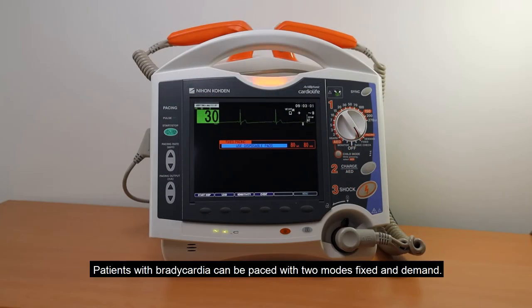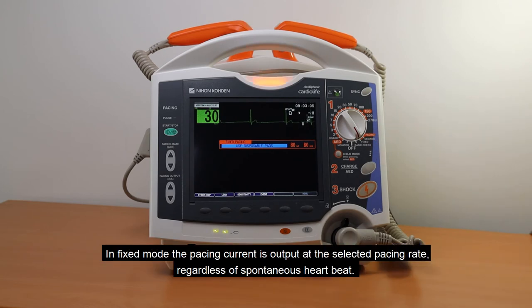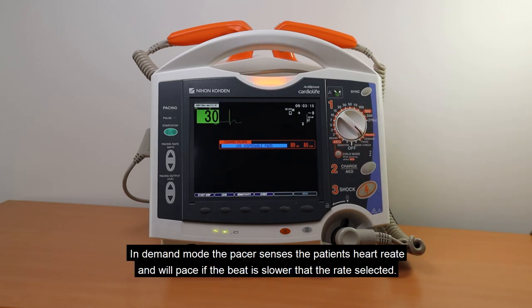Patients with bradycardia can be paced with two modes: fixed and demand. In fixed mode, the pacing current is output at the selected pacing rate regardless of spontaneous heartbeat. In demand mode, the pacer senses the patient's heart rate and will pace if the beat is slower than the rate selected.